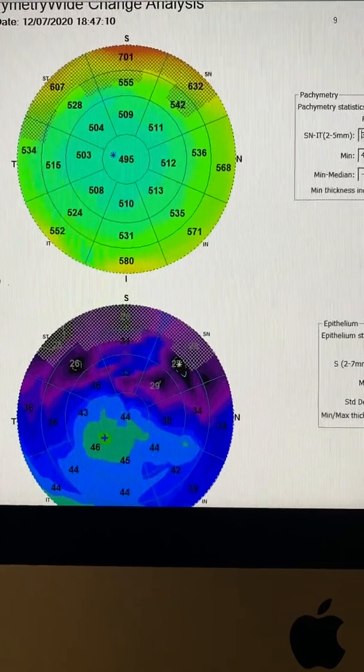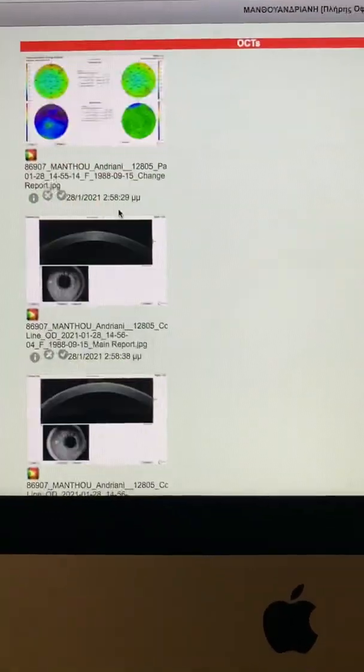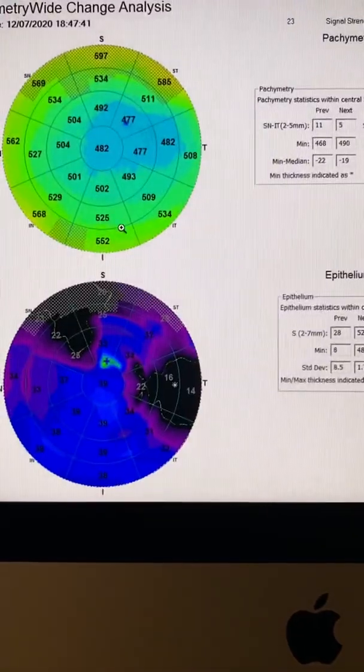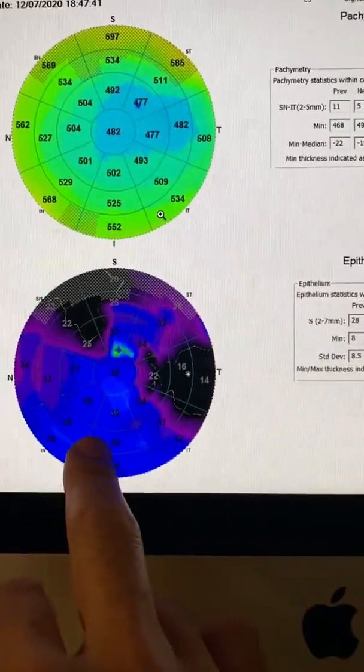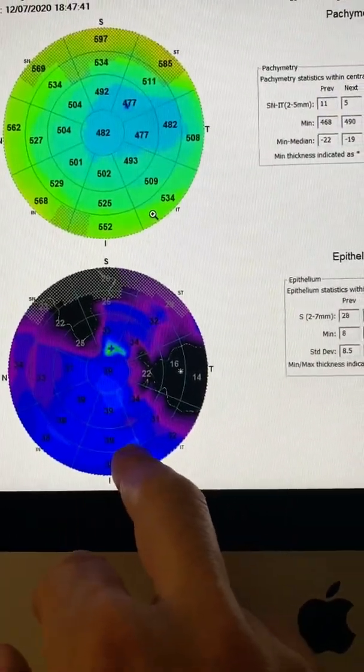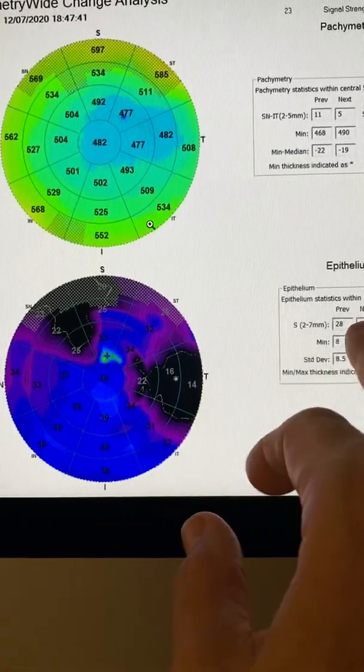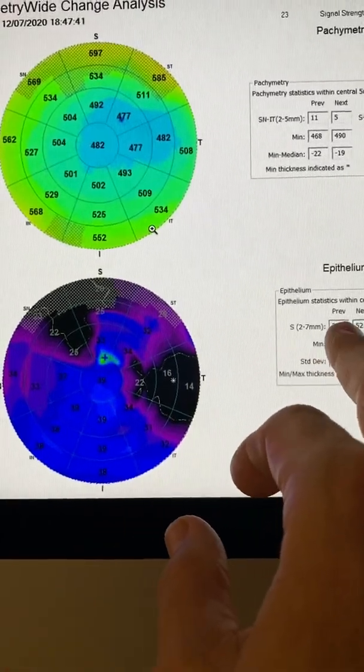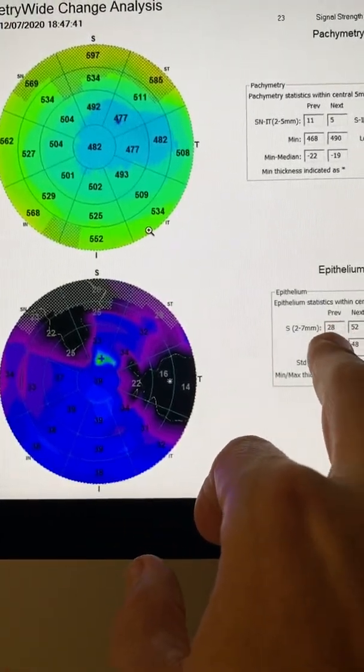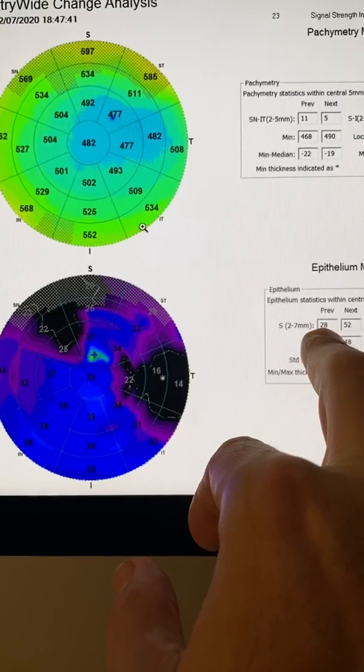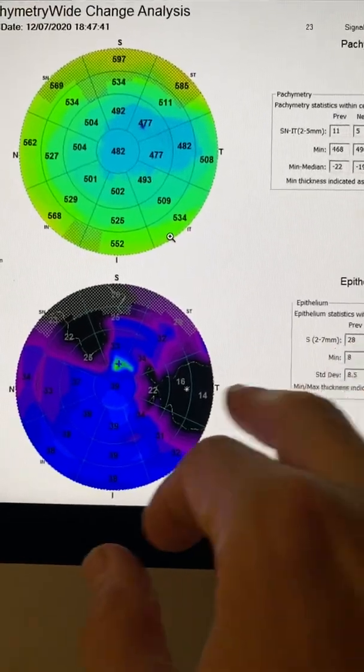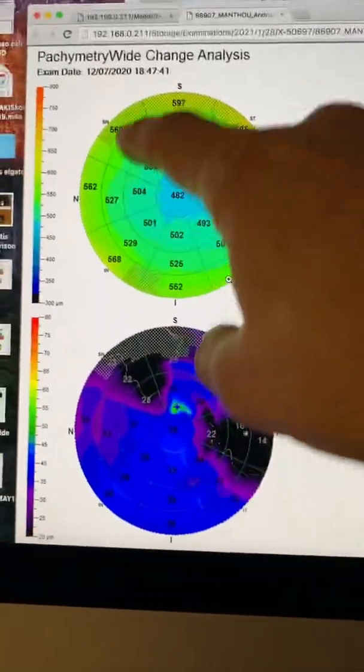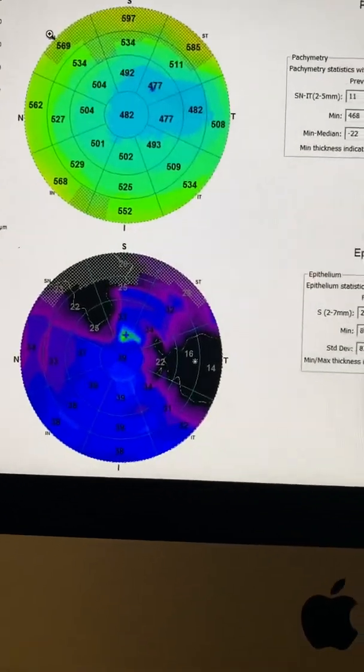If we look at the same images for her left eye, even worse. The average epithelial thickness has dropped to a minimum of 28 microns in some areas, basically stripping the cornea from epithelium. Very severe, and also making the total cornea thickness look very irregular.